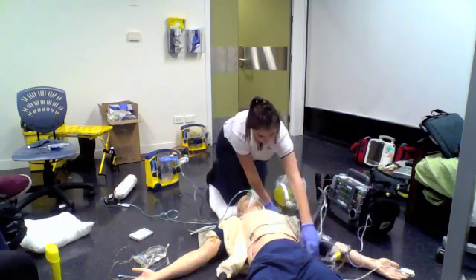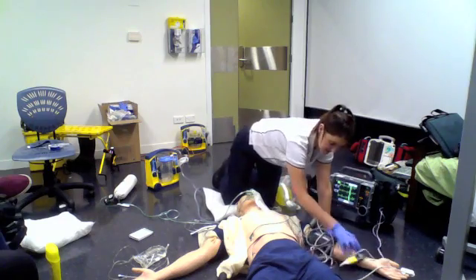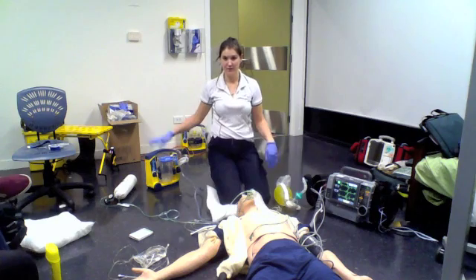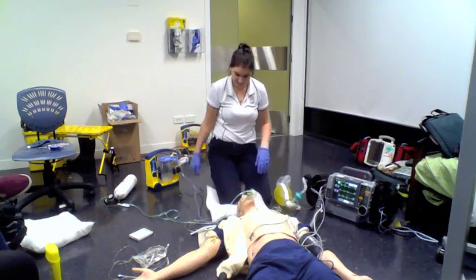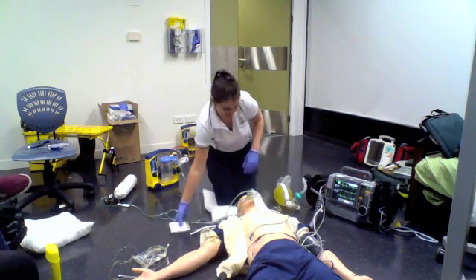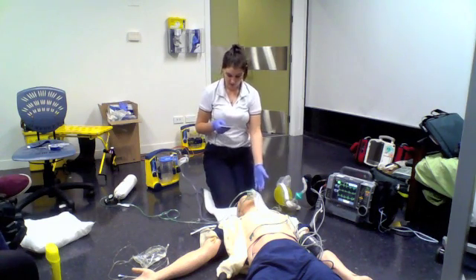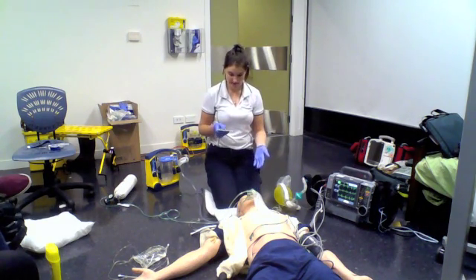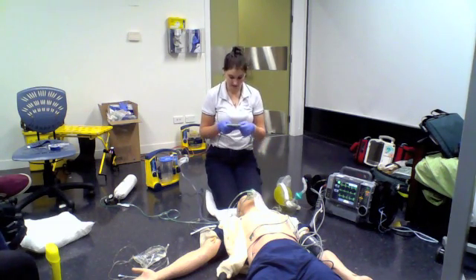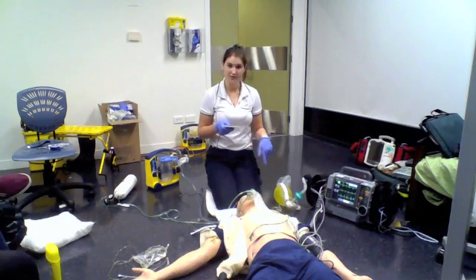Move all that away. We want both sides of the patient to be accessible, so that's all good there. We can see the monitor, and we've got the oxygen and the suction unit close by. I'm then going to do the RSI checklist. So, attach nasal prongs for supplementary oxygen, which we've done. We've pre-oxygenated the patient for 10 minutes before the ICP arrives with the reservoir mask. We've attached ECG, NIBP and SpO2 monitor.